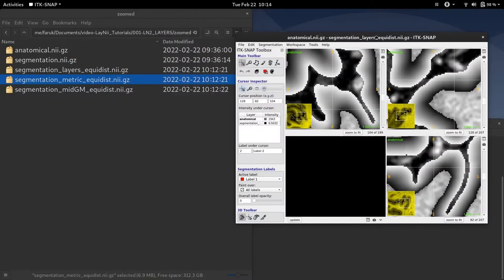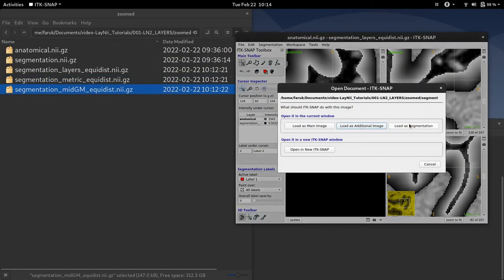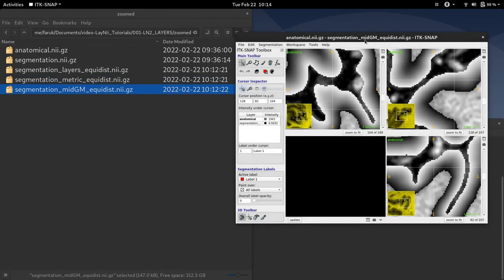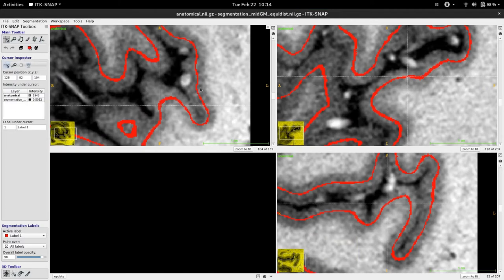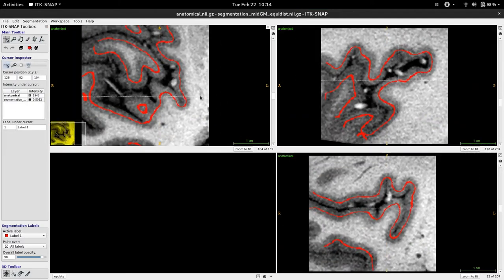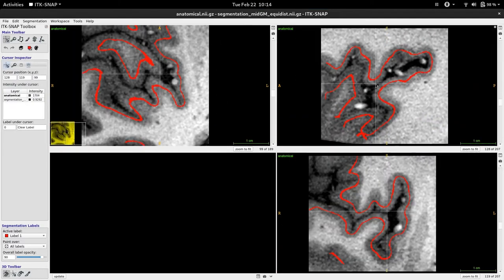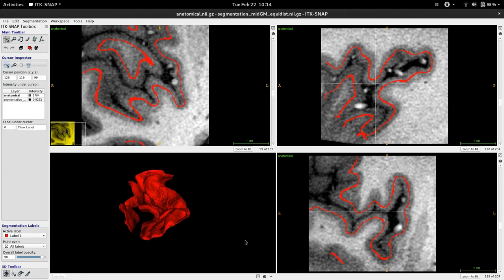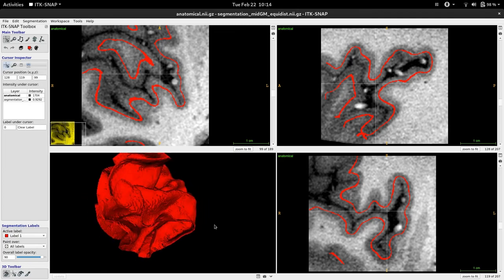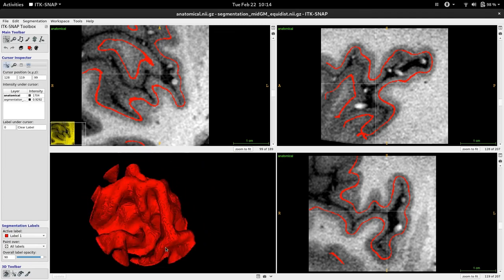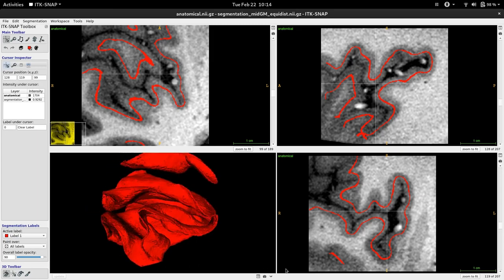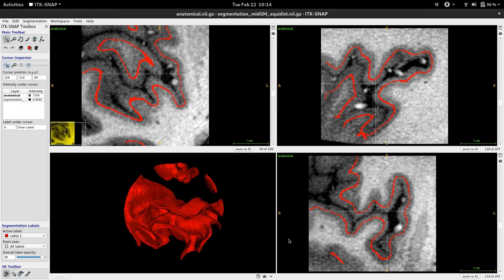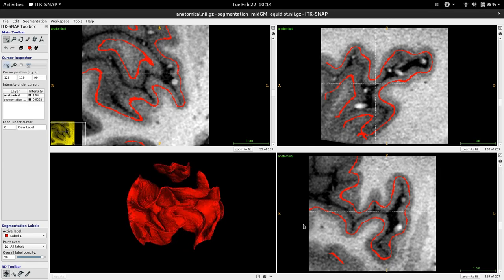And for the final part I would like to show you the mid gray matter file and how we use it. Okay, here is the mid gray matter file that I load as a segmentation. And the handy feature of having this output is that now we can use the 3D mesh viewer to quickly generate a mid gray matter mesh to inspect our morphology in the region that we segmented. Looks pretty good.